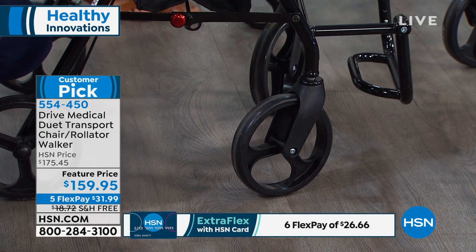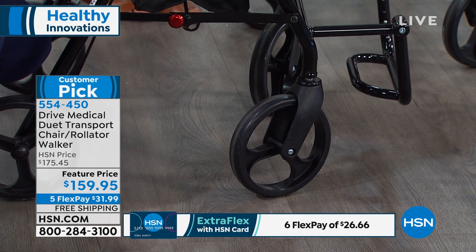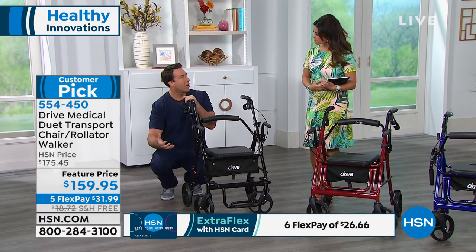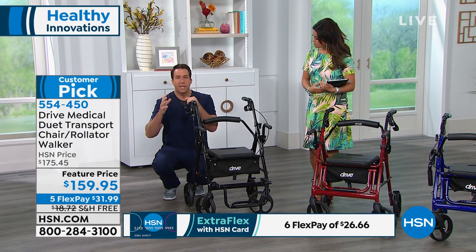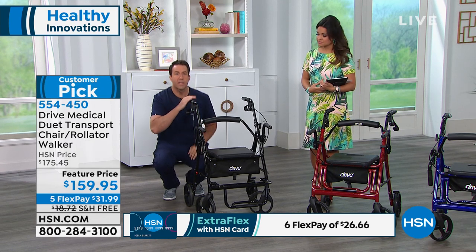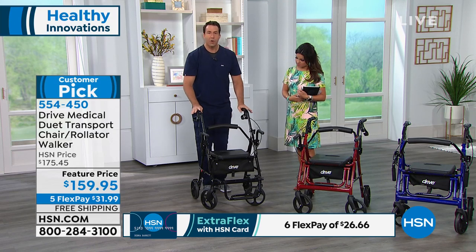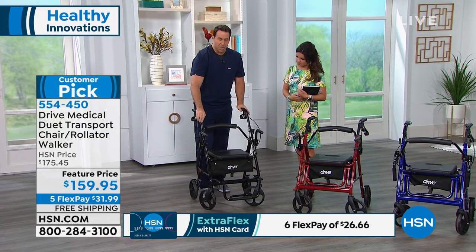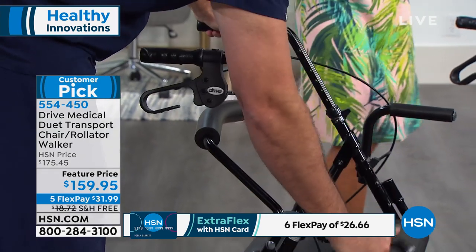As a registered nurse, you want to be safe, backed up with a limited lifetime warranty. Get your product through a trusted source like HSN. Drive Medical also gives you tool-free assembly on your Duet — when you get it home, all you need to do is slide the ergonomic handrails in, adjust them at your height level, and right out of the box it's that easy. So I'm going to fold these down here to show you how this will come.